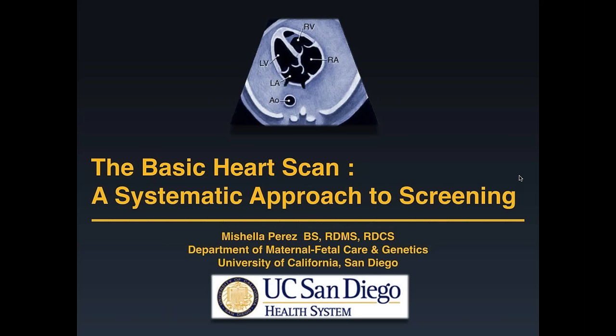Also, does 3D help in fetal echo? 3D may be very helpful to include as a supplement to fetal echo. As you know, with 3D, we are able to see structures, but the only downfall with 3D is that the resolution does get distorted.